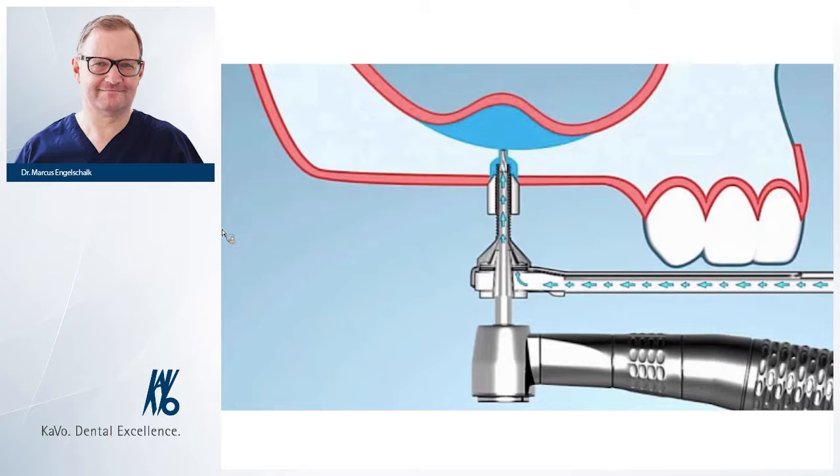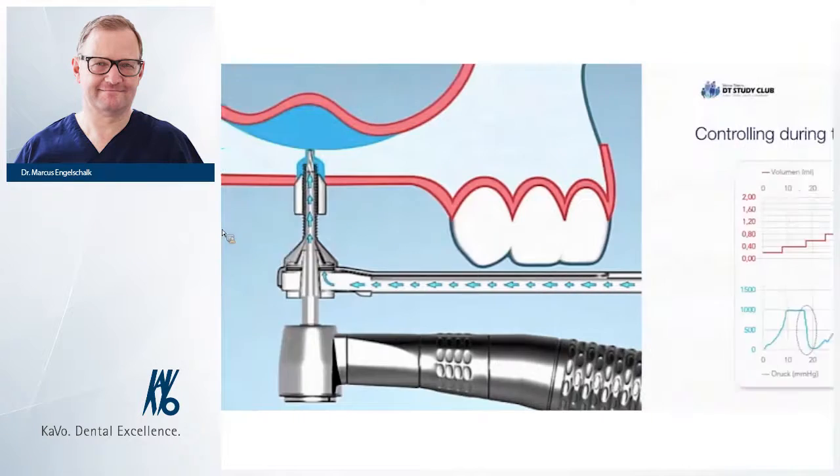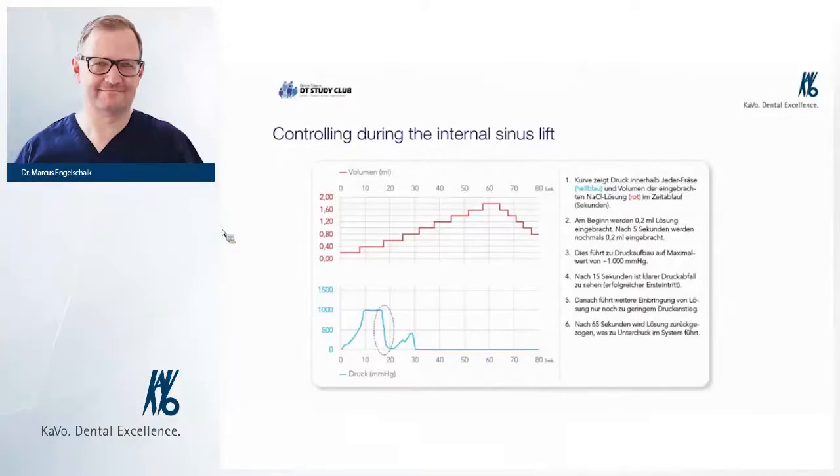Well, a short example, you see we lifted mesial, and you see that it's like a hill-shaped augmentation we reached. In this case, this is nearly 3.0 millimeters residual bone height, and we can augment it. And for this technique, you always have the shape of a hill of the augmentation. You see it works very fine with the augmentation.